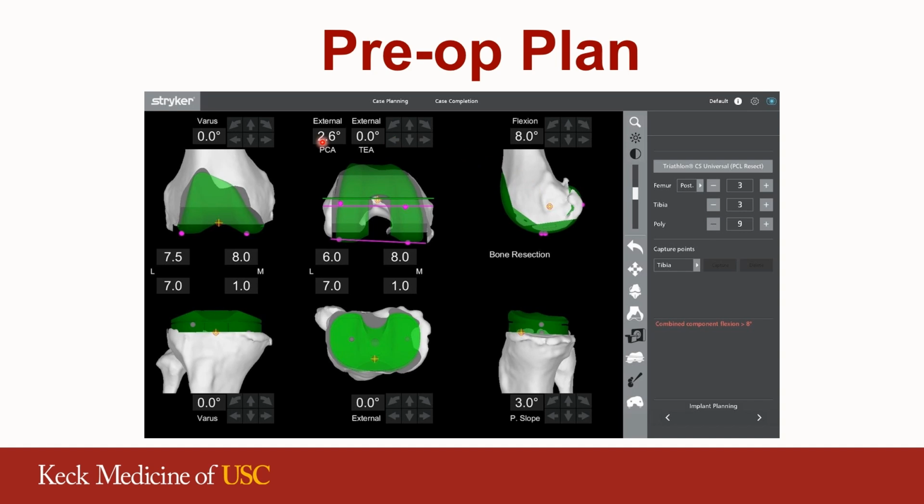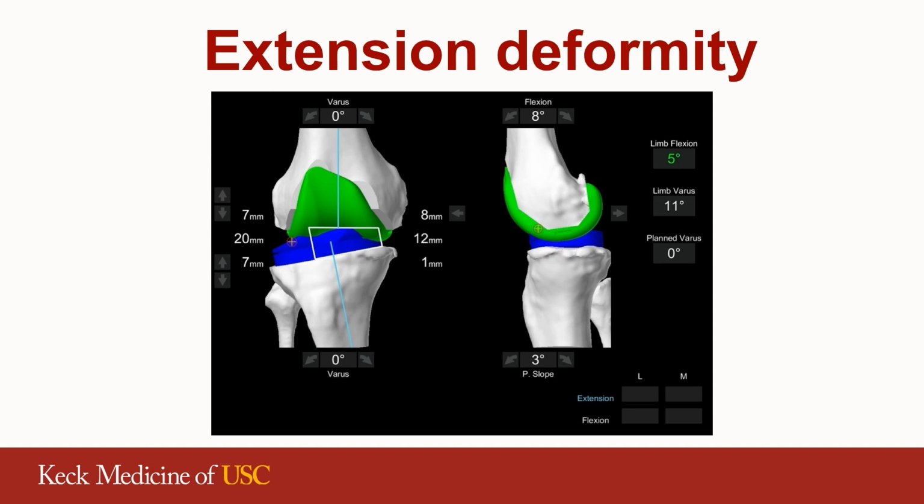This would be the plan if we were to pursue classic mechanical alignment with the plan of secondary releases to achieve balance. With robotics, however, we have an alternative of being able to make slight adjustments through the cuts themselves so that we don't have to rely completely on soft tissue balances from 0 degree alignment landmarks.